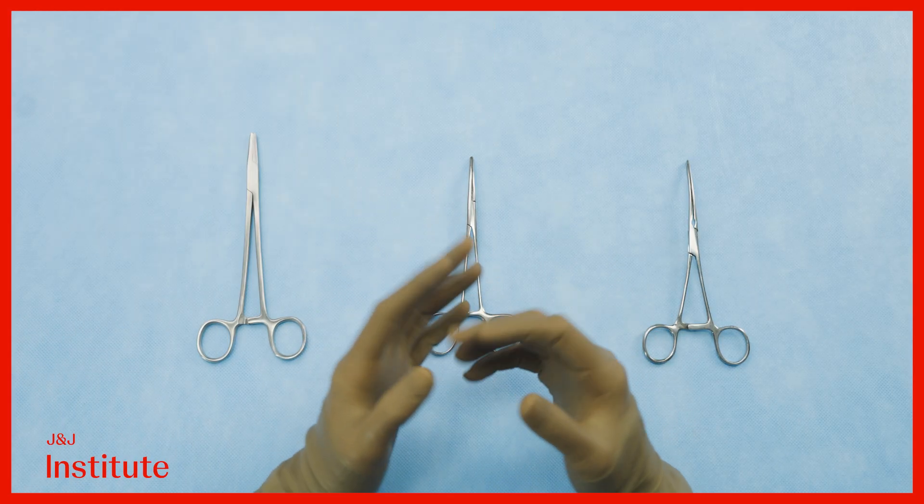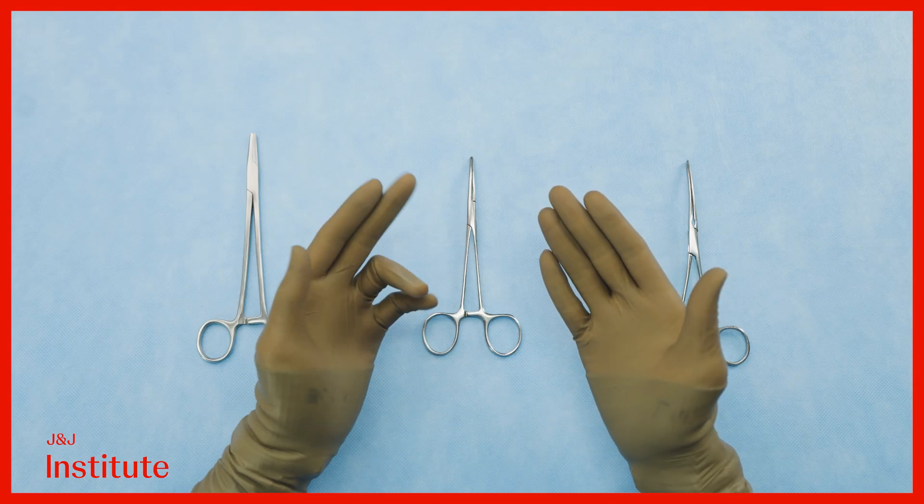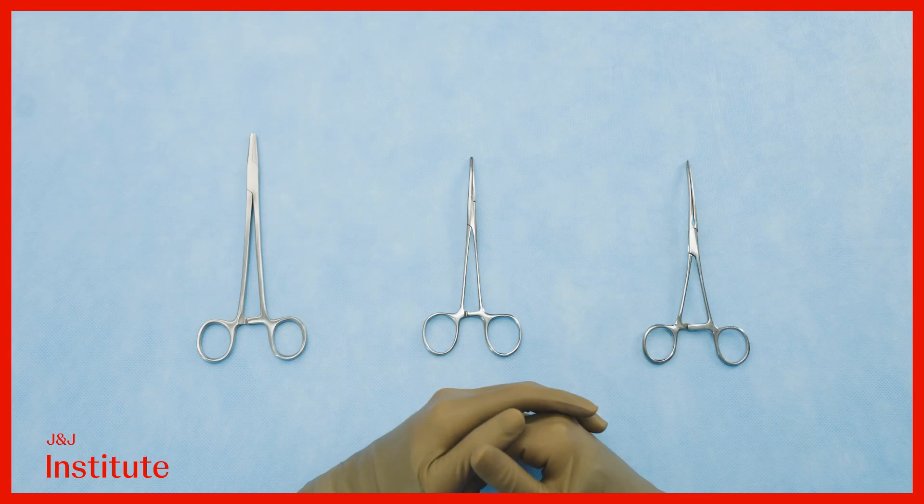It is important for us to learn how to handle instruments well, since they truly are the surgical extension of our hands. In this module we will cover some open surgical instruments.